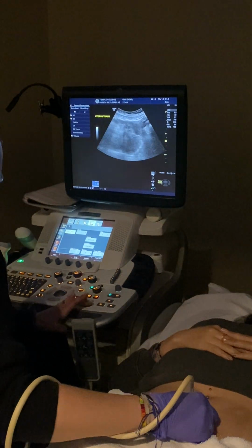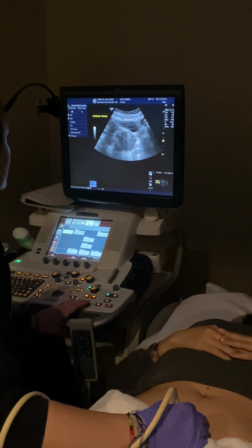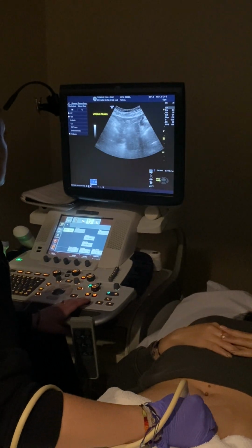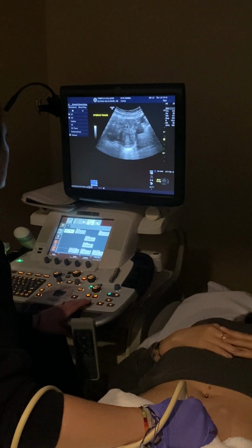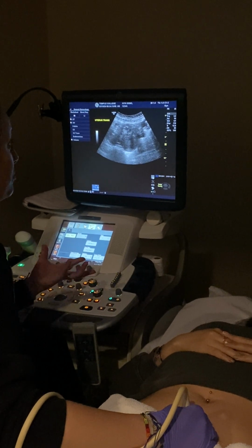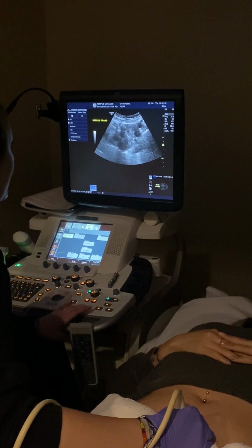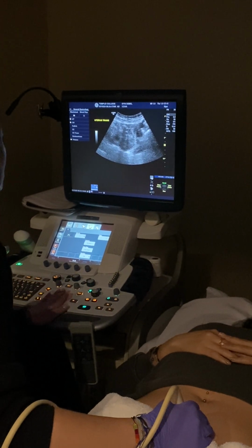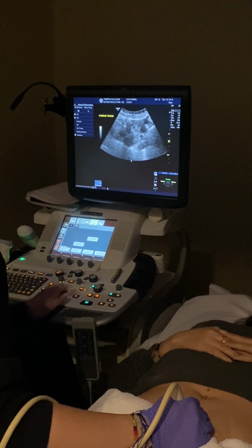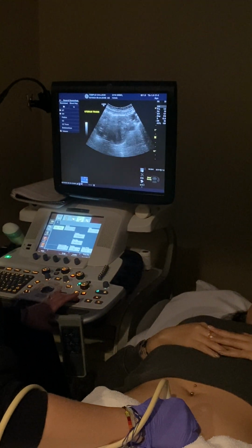So when we go in trans and do that, straight from the cervix up, that's lower uterine segment. I have to adjust a little bit. You doing okay? Mm-hmm. All right. Now where it's at its widest, where I would take my measurement, would be your body, and then all the way up and through, and then back, and that is the fundus. She got some bowel gas moving around here, so it's a little bit tricky, but can you guys see? Yeah. Just that little piece there. So fundus.